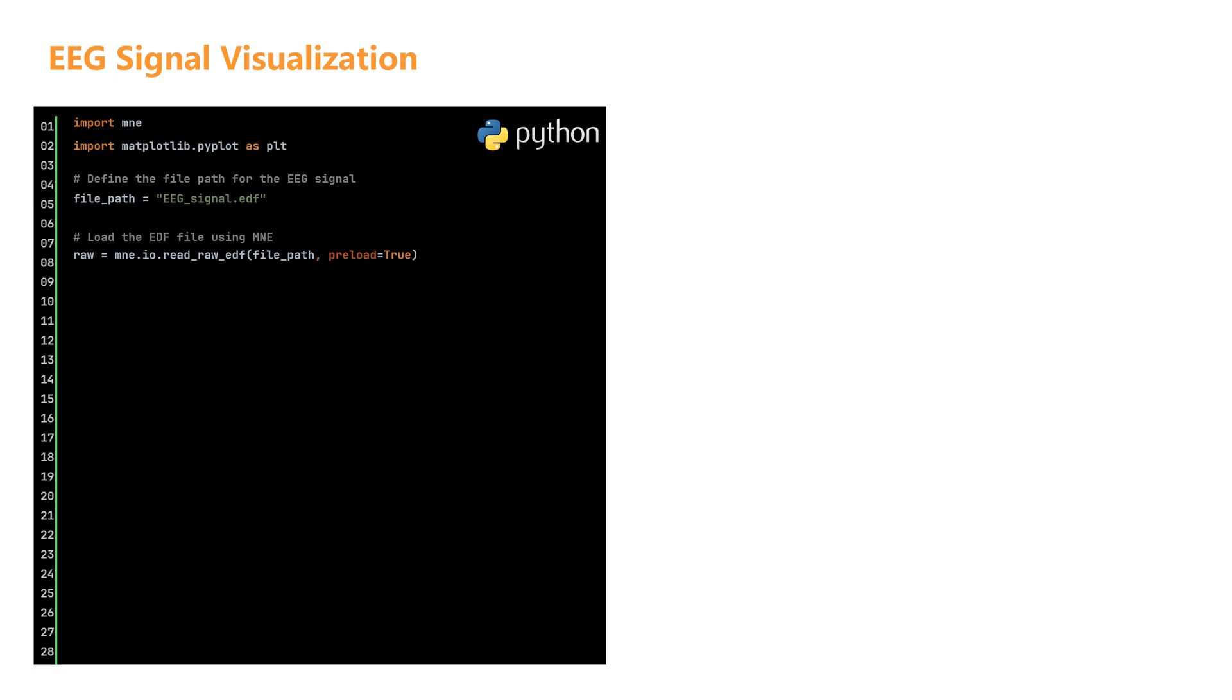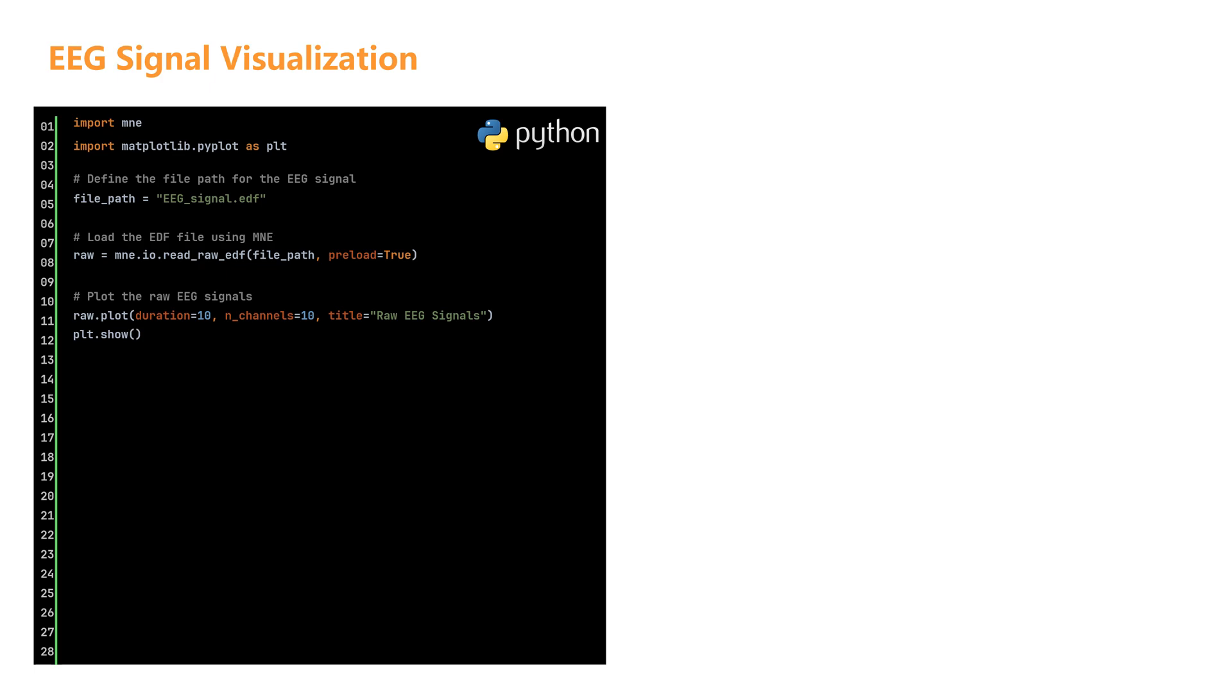The MNE library offers powerful built-in methods for visualizing data. These methods can be applied using the following code. In this example, we use the raw.plot method to display EEG signals. Two key parameters are specified: duration equals 10 shows 10 seconds of data per page, and n_channels equals 10 displays 10 channels per page.